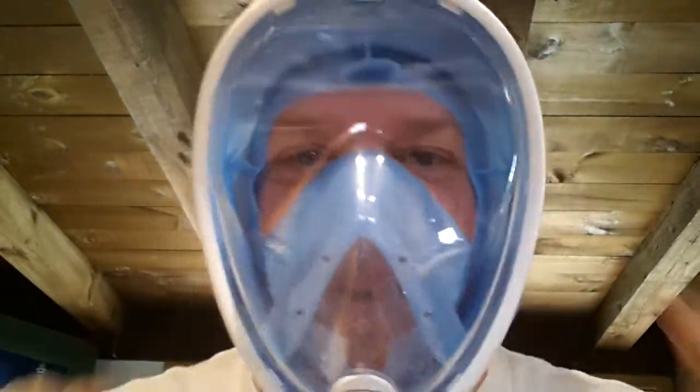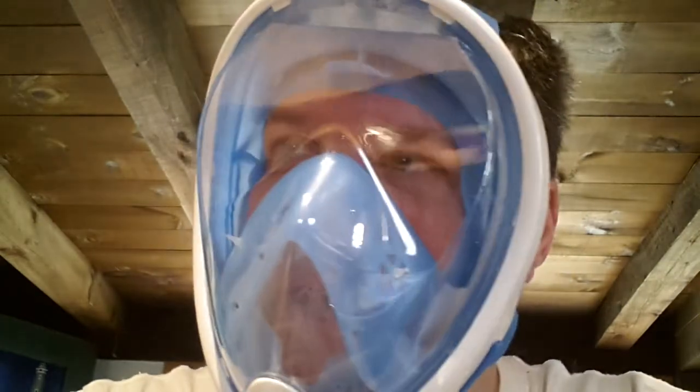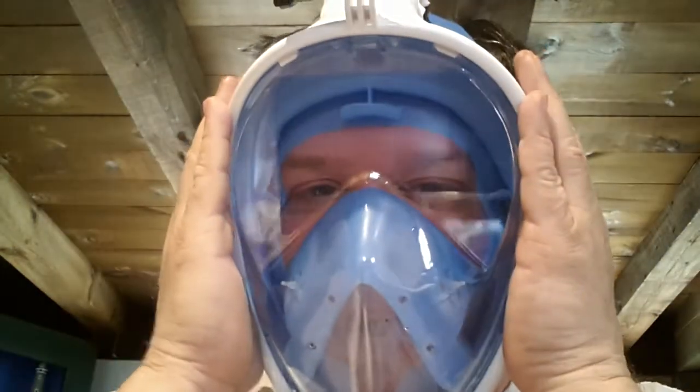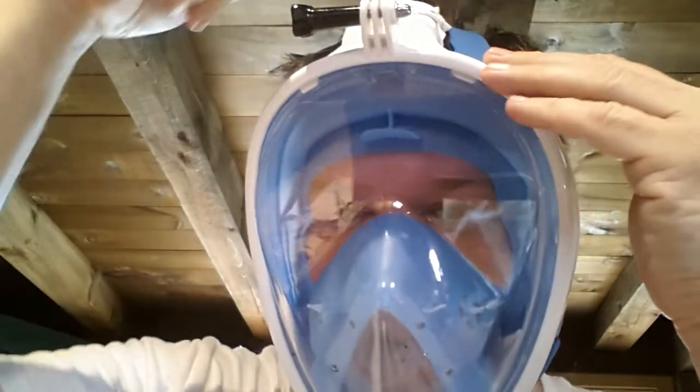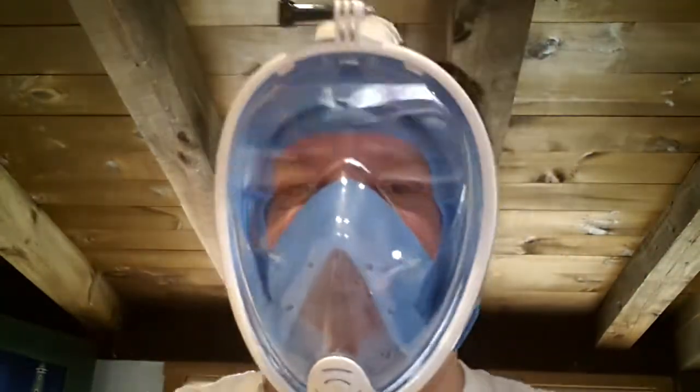Emperor Penguin — I hope you can hear me with this on. It's actually quite comfortable. There's a little bit of outgassing from the medical silicone in here, so I don't have to worry about it — eventually it'll outgas and you won't smell it as much. Just because I don't have the snorkel valve on the top, the air is going in and out of both places, but this is going to work out very well.